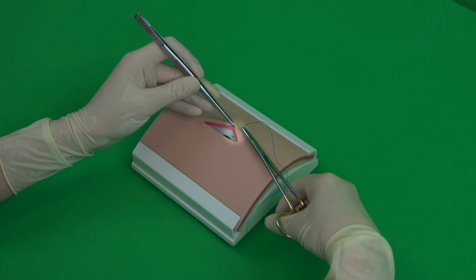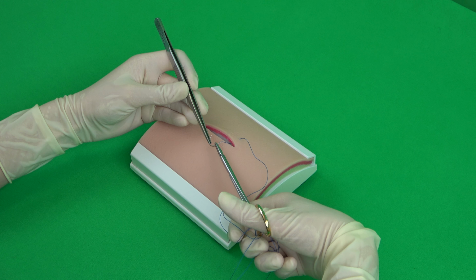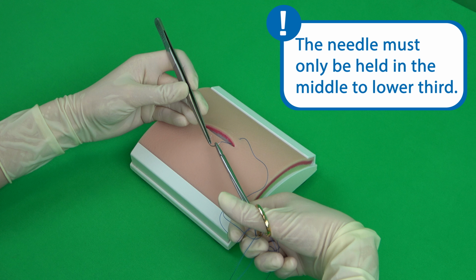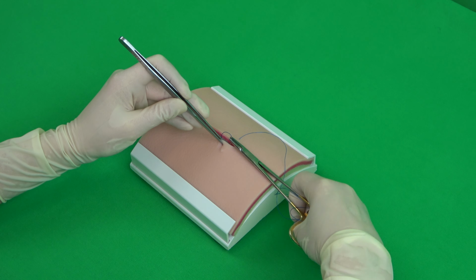The needle is driven perpendicular and with minimal distance to the wound gap. The needle is held with the forceps, allowing the needle holder to grasp the middle to lower third of the needle. In the next step, the opposing edge of the wound is lifted with the forceps and the needle is driven from the inside out.